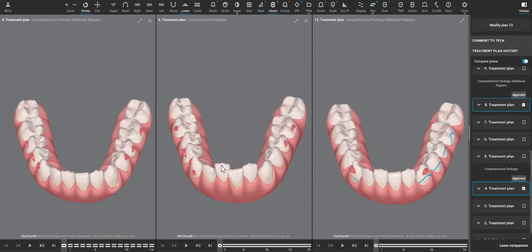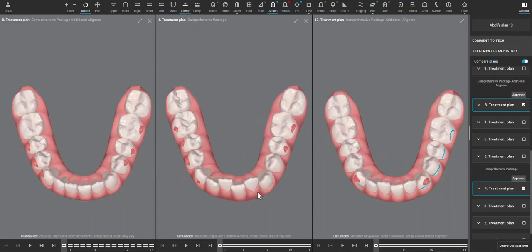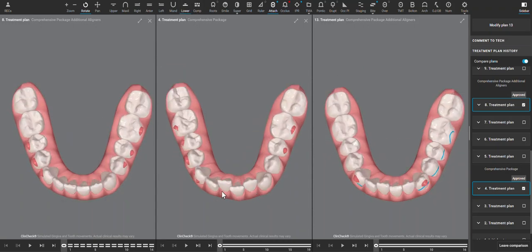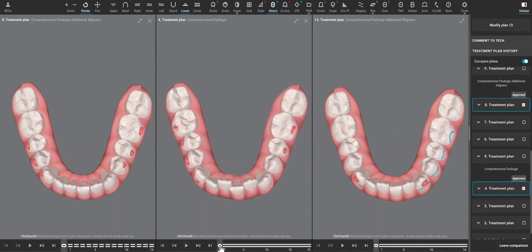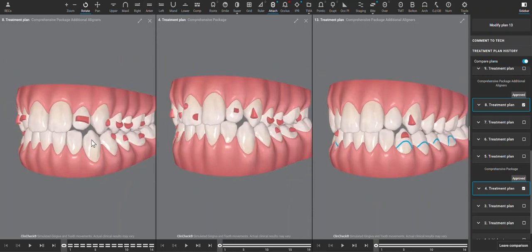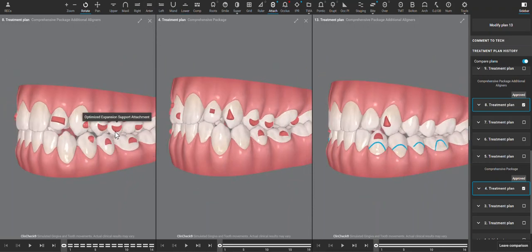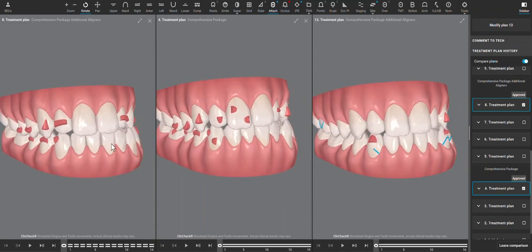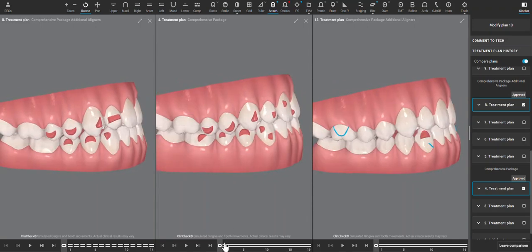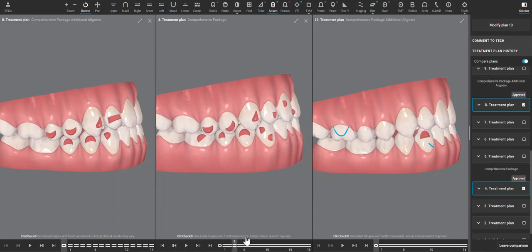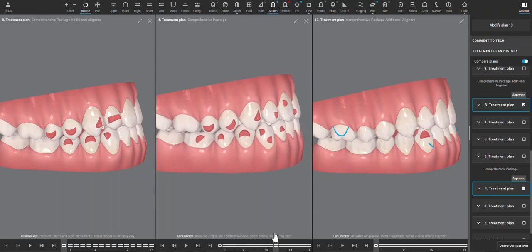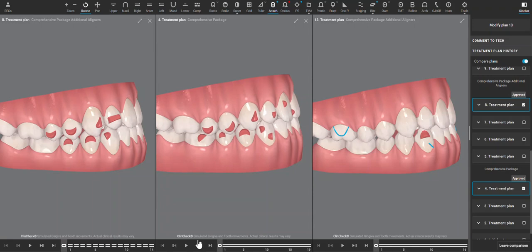And that makes sense because the buccal movements are the easiest for the teeth to do. Those crown buccal-lingual movements have very little resistance, so that's where we did get some benefit. While a lot of these teeth were still hung up, even first molar movements are very unpredictable, and the entire AP change that is presented here is not likely to happen clinically.